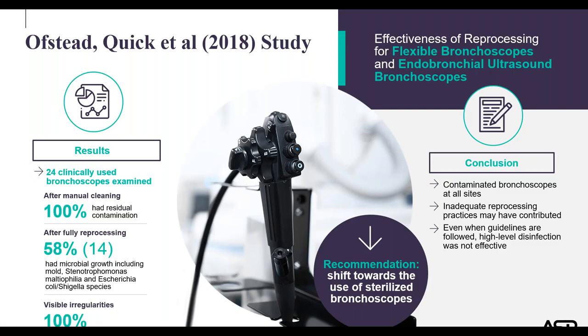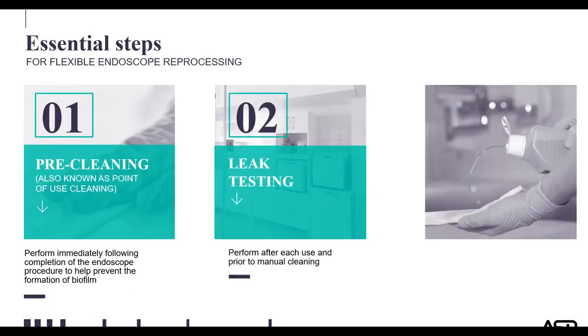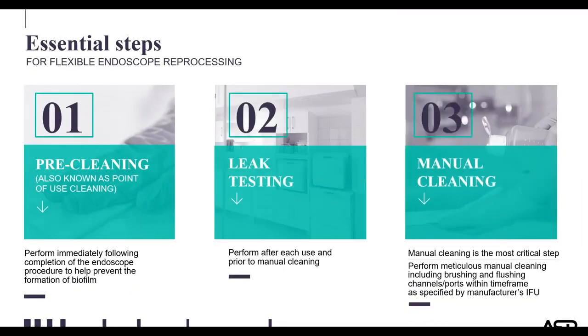So Janet, I'm now going to hand it back to you, and Janet's going to not only take us home, but she's going to go through some of the essential steps required when reprocessing a flexible bronchoscope. Janet? Thanks, Reggie. Do you have the tools to do the correct job of reprocessing laryngoscopes and bronchoscopes?